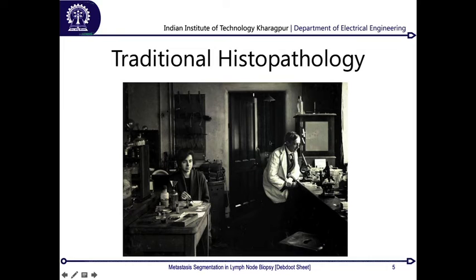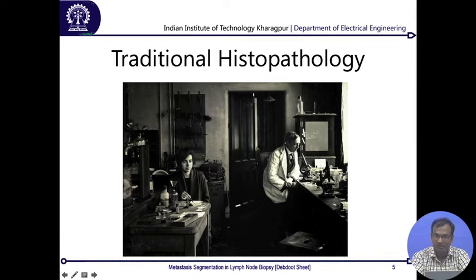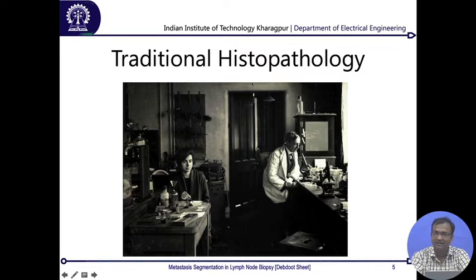Then there is a pathologist, who is a trained clinician, a medical doctor, who looks through different regions of the tissue mass and finds out how it is. This is the traditional practice which is followed to date in major parts of India and in major hospital chains. But the major issue is that it is a manual procedure. You have to take a slide, put it down, and observe it with a microscope, and these slides are not everlasting, so you cannot preserve them forever.